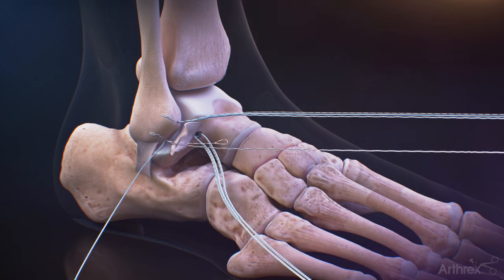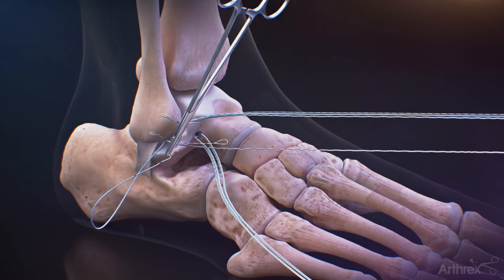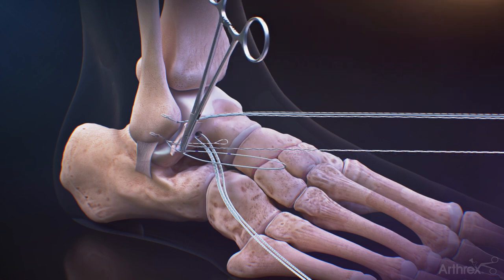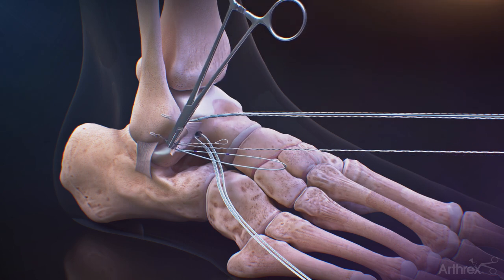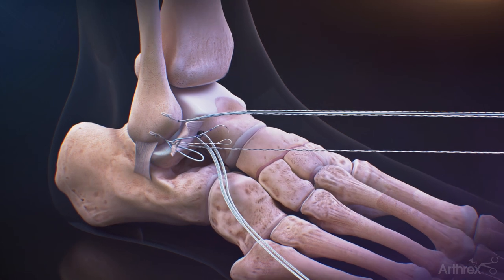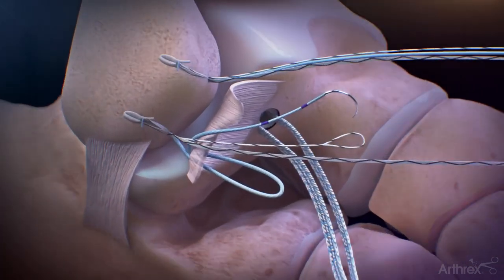Pass the needle from the blue working stitch from the DX Knotless fiber tack through the ligament in a mattress fashion. Once the suture is passed, cut the needle off at the purple marking on the suture closest to the needle.